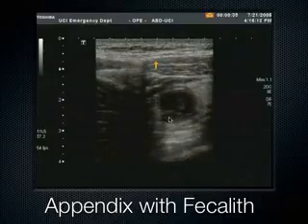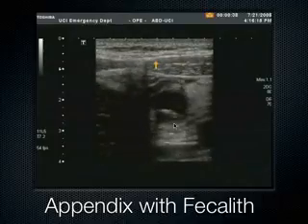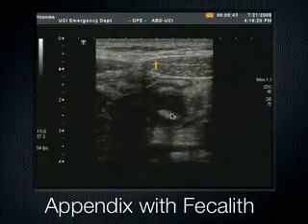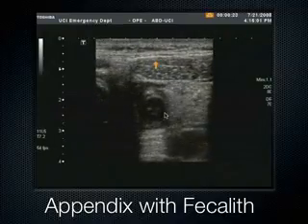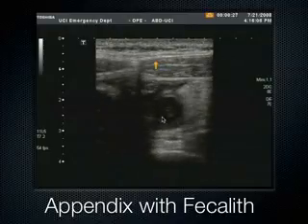So this is a patient who's got a fecalith. You'll see that hyperechoic structure. That's a stone with a shadow behind it blocking this appendix, and that's why the patient ended up with appendicitis in the first place. So sometimes you'll have trouble finding the appendix, only to realize that there's a fecalith. It's blocking the sound, which makes it hard to see the appendix.